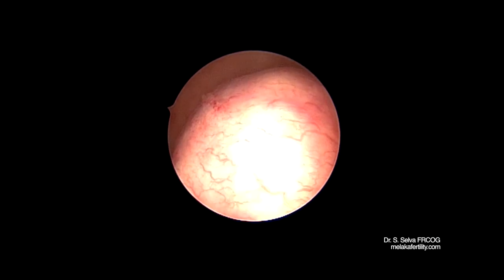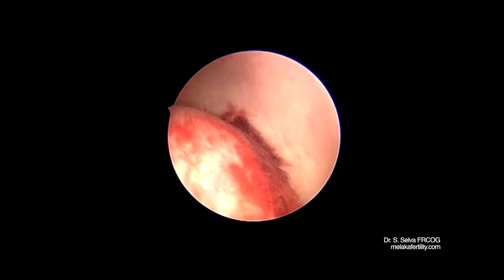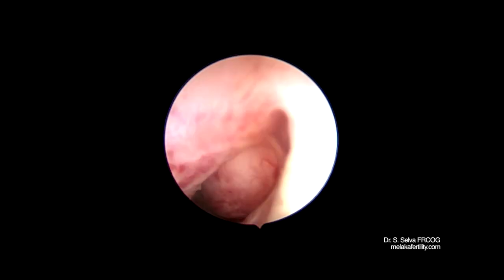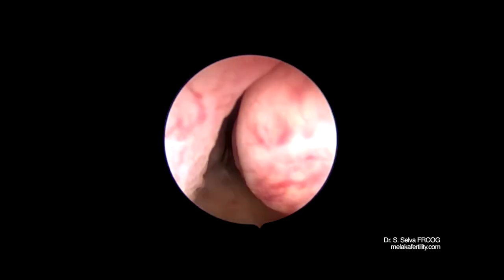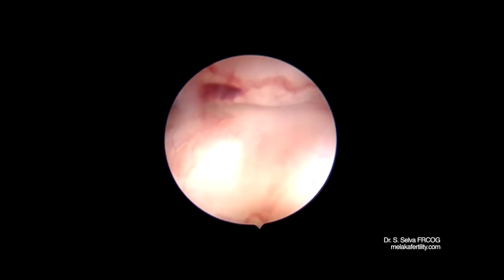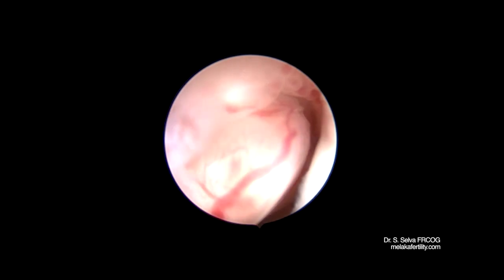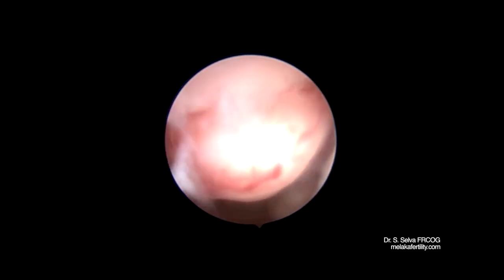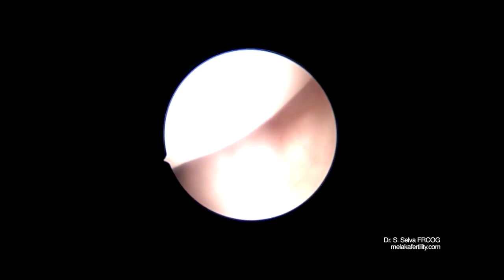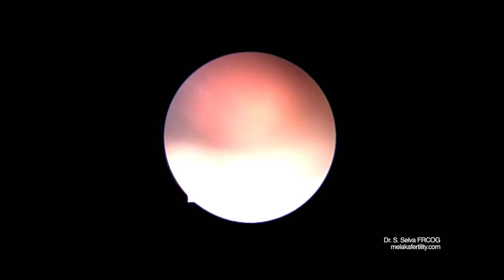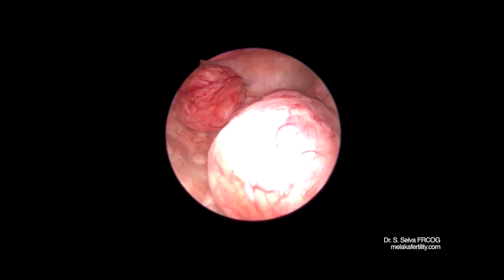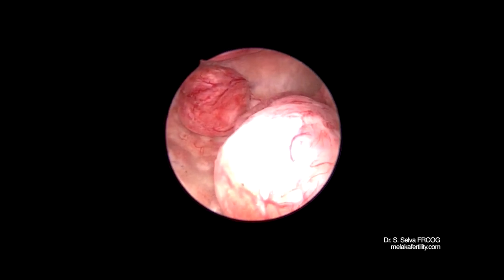This is a large posterior wall submucous fibroid. This video shows a woman with multiple submucous fibroids. These fibroids are near the internal os. She had many submucous fibroids of varying sizes.